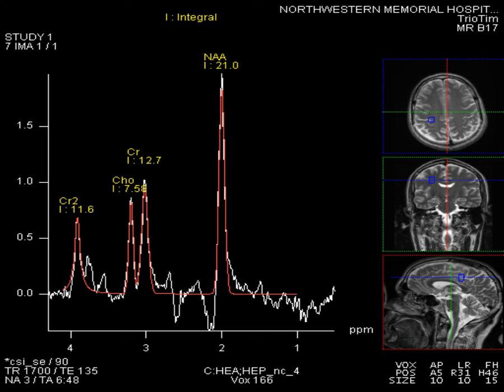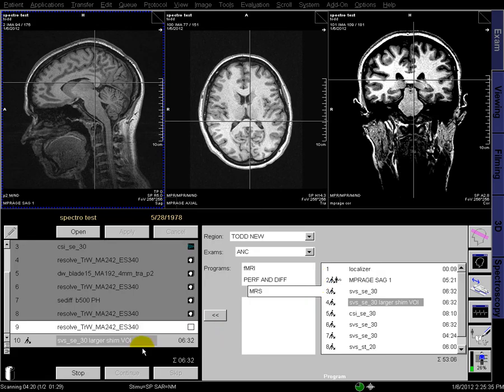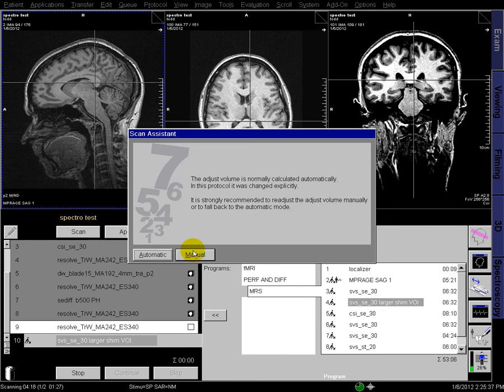This video is going to show how to set up a single voxel MRS experiment. First we select the sequence, then we're asked if we want to manually or automatically place the adjust volume for the shimming. In this case I'm going to show you how to do it manually, but typically you'll have automatic placement of this volume of interest.